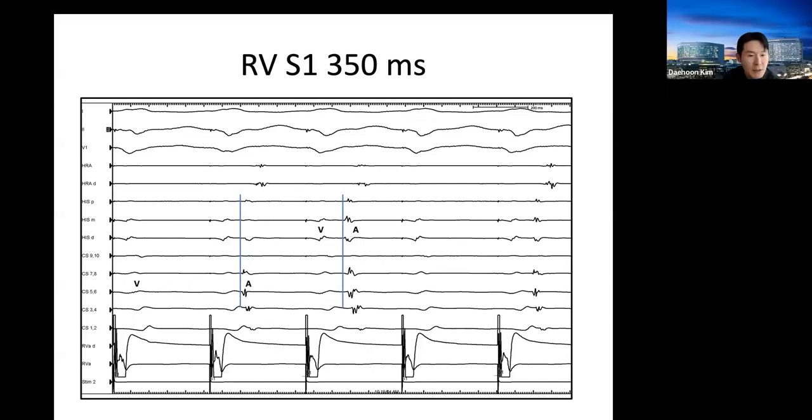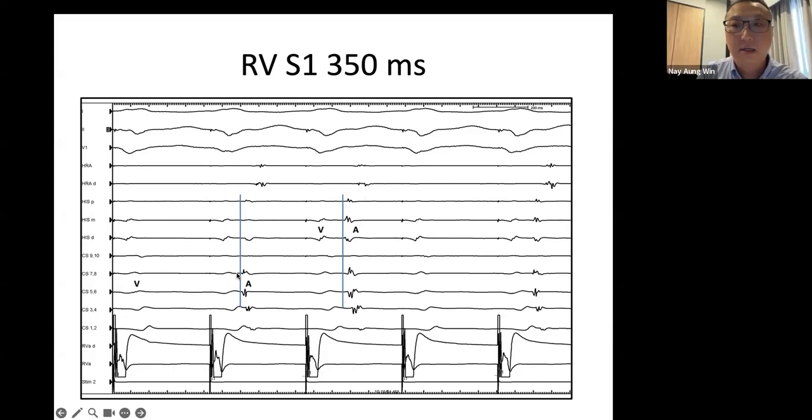How about the last bit? It also says 7-8 and His is similarly early. Last VA. Here, no, last bit, last pacing bit. Yeah, there, at the same time between the His and the CS.